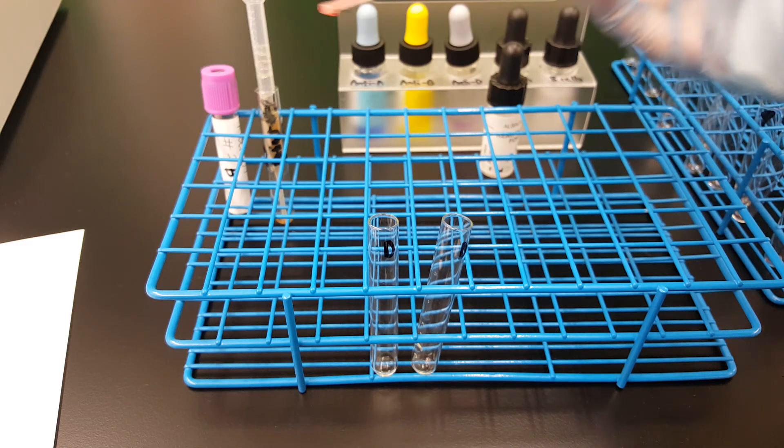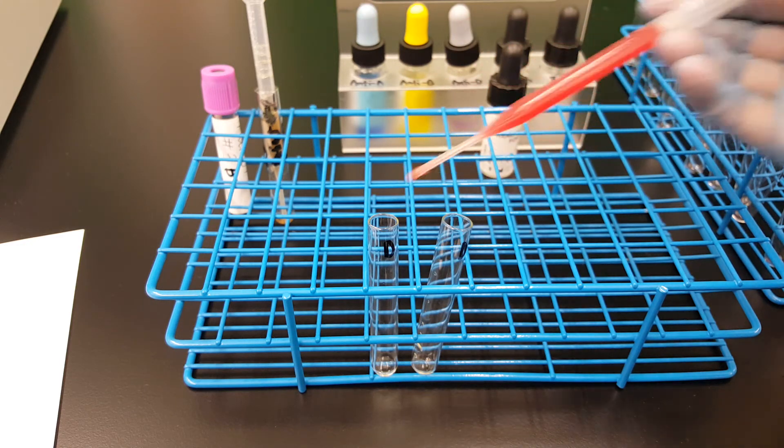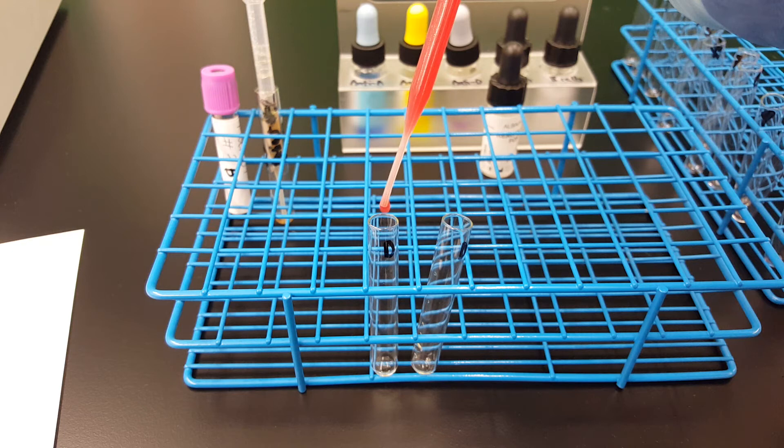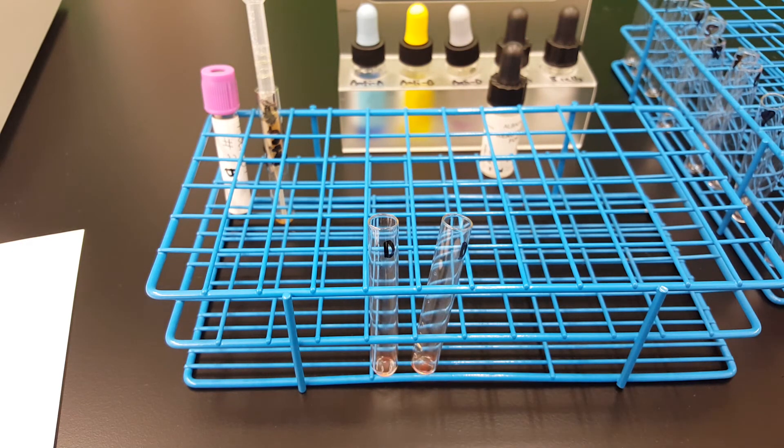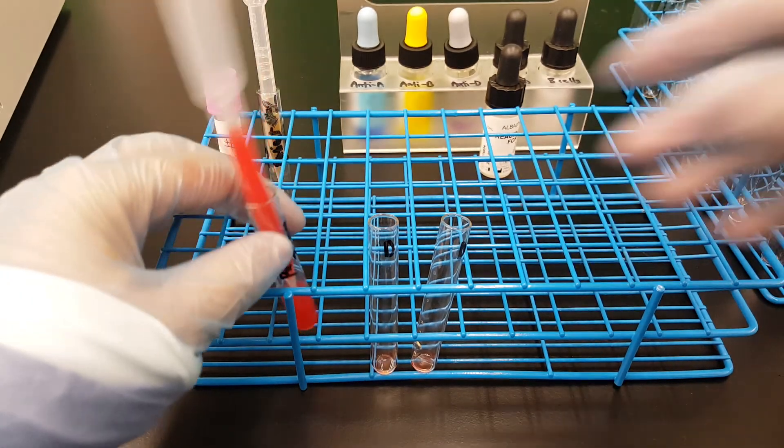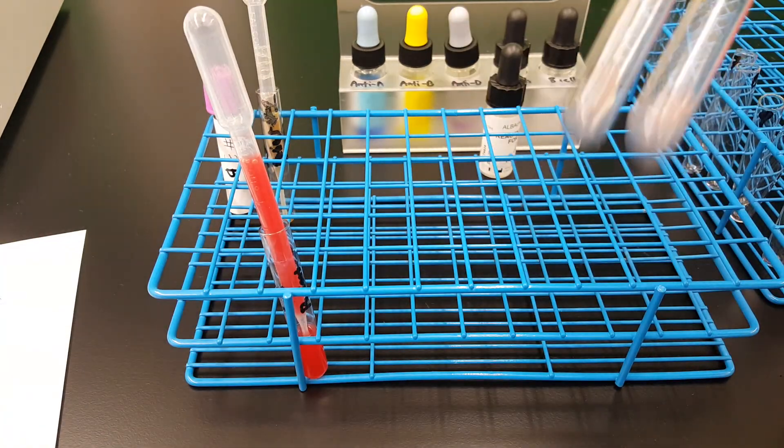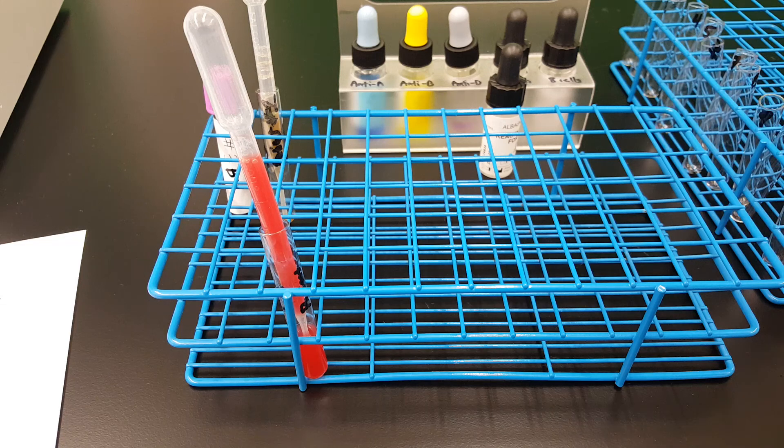So we added one drop of each of the reagents to each of the tubes. Now I'm going to add one drop of my red cell suspension to each of the tubes, and I'm going to spin them for 15 seconds.